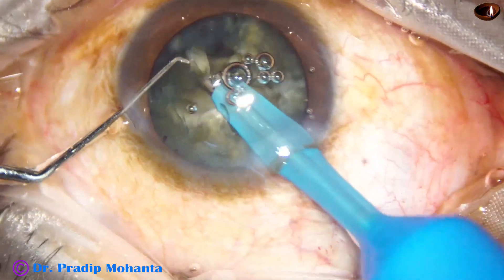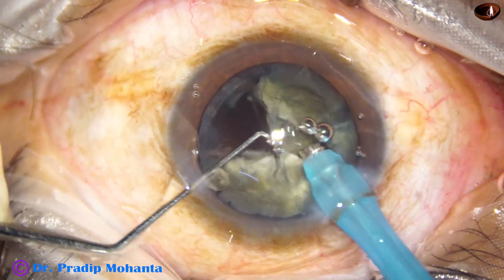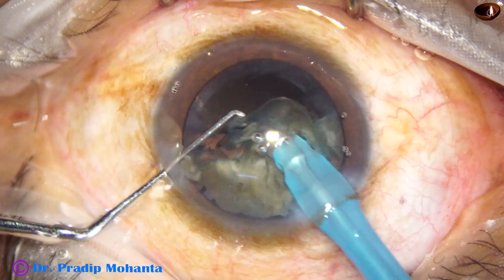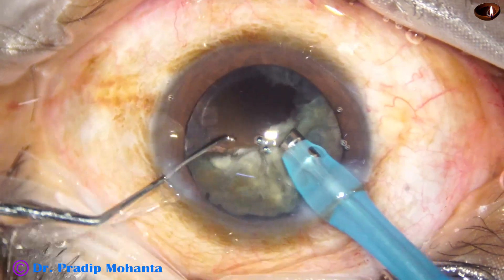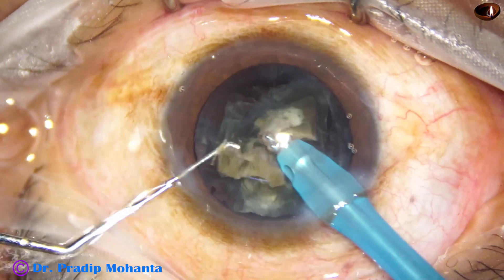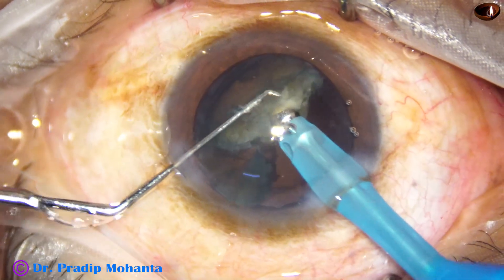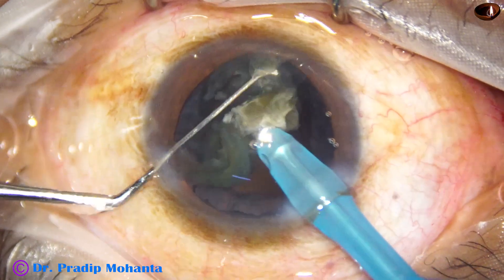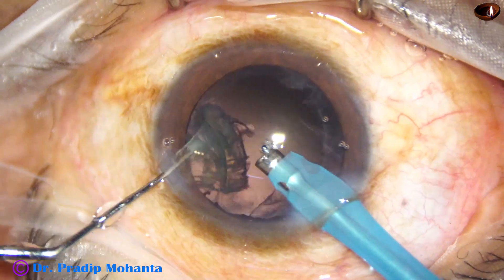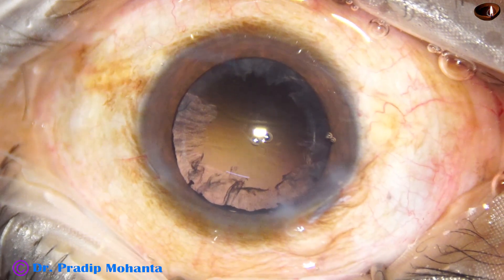Now each fragment is emulsified. Each fragment is subdivided into smaller pieces — starting at the apex, it is emulsified easily. Rotating, I start from the apex again, and I detach the epinucleus to protect the posterior capsule.